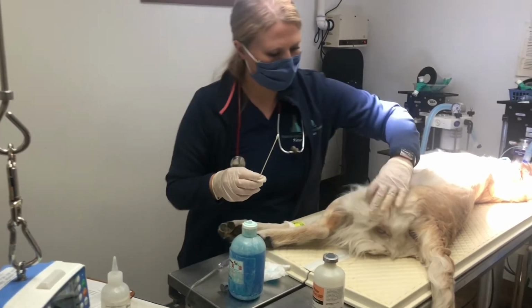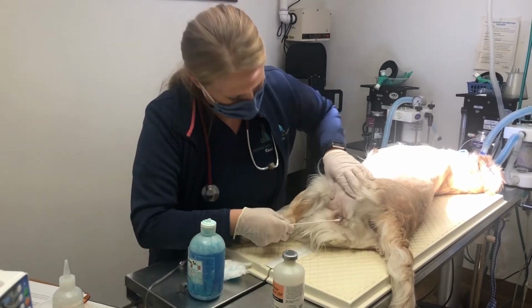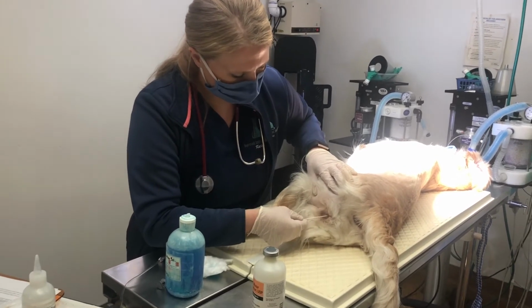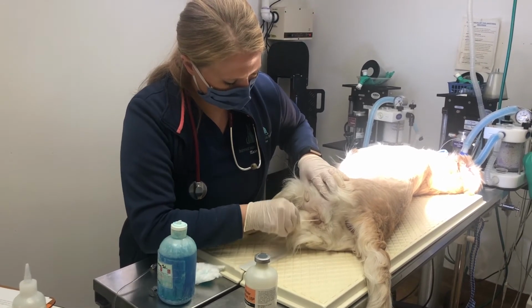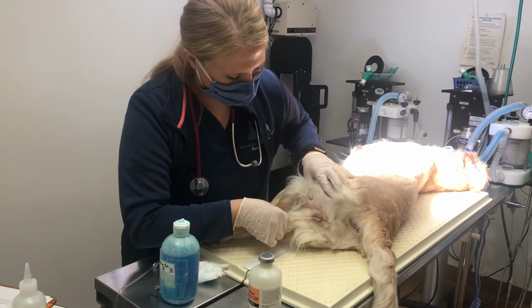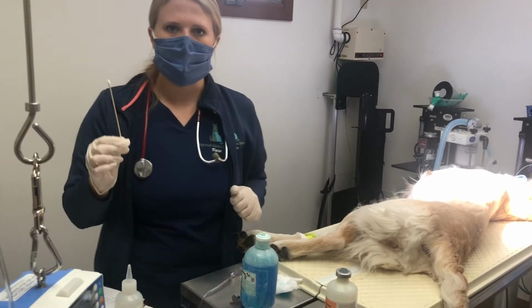And then I'm going to insert the cotton swab up into the vagina, initially at a very steep angle. And then once you're in a few inches, you can let it relax to 40 degrees. And I'm going to spin it about 2 to 3 times to get my epithelial cells, and then slowly pull out. And then I will go roll this onto the microscope slide.